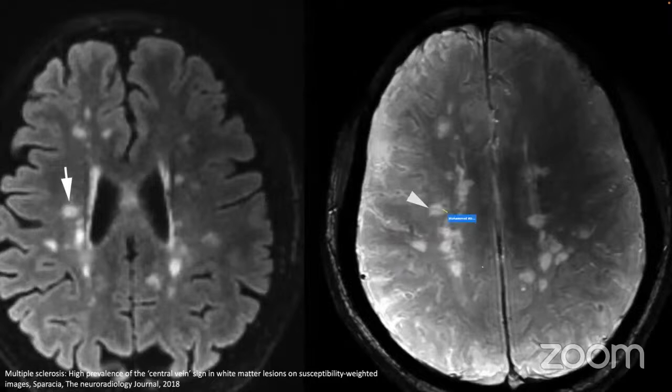This is a gradient echo sequence, and this is a vein. This is a vein. This is a vein as well. Sometimes these veins are traveling sideways, like in this direction, but some veins are traveling upside or down, upwards. So you would be able to pick it as a dot, which is this lesion. This lesion here is an example.